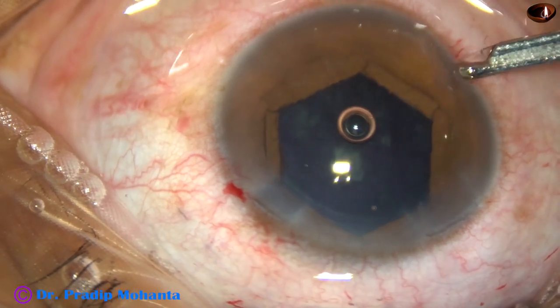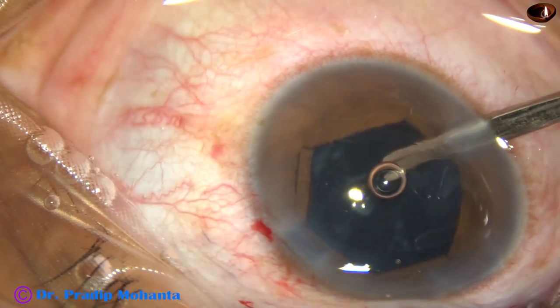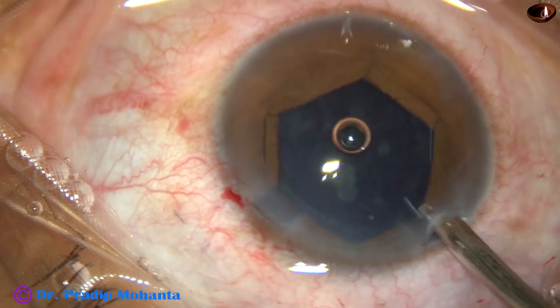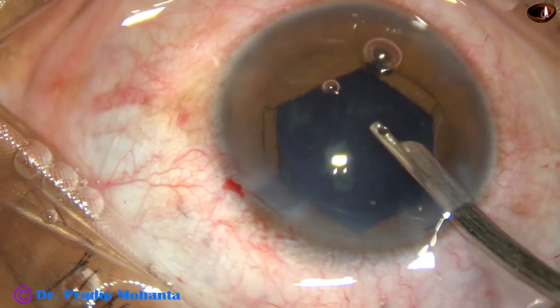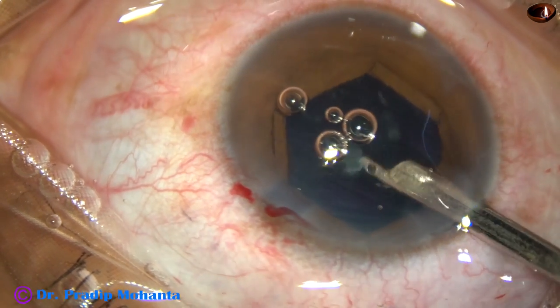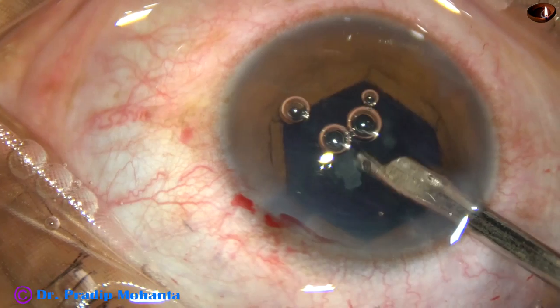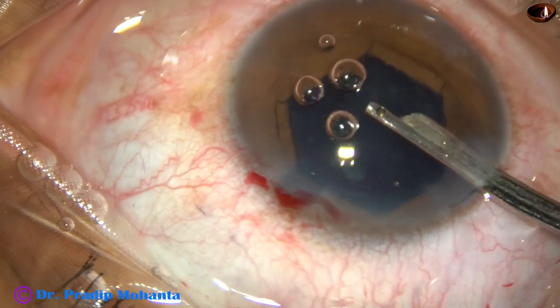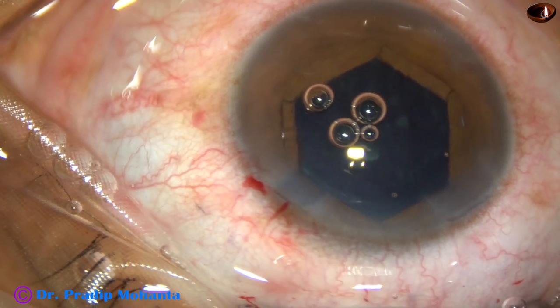By this time, the cortex has been removed by a 23G Simcoe. Now in this case, we have to implant an intraocular lens. You don't see any red reflex in this case — rather, a black reflex.